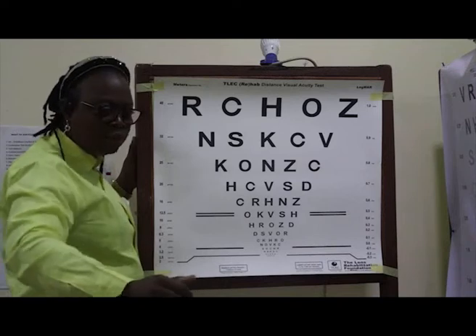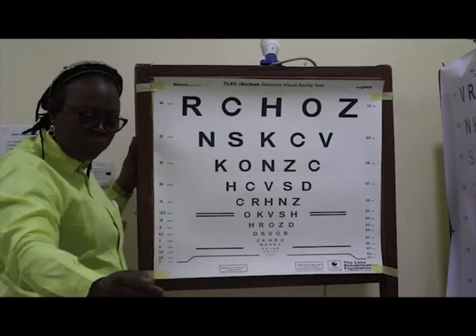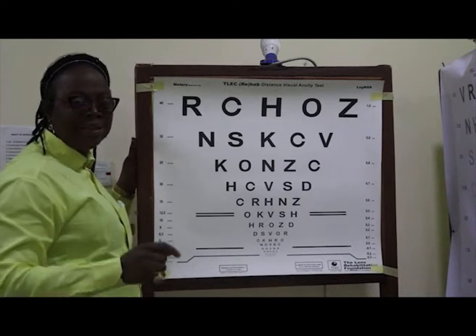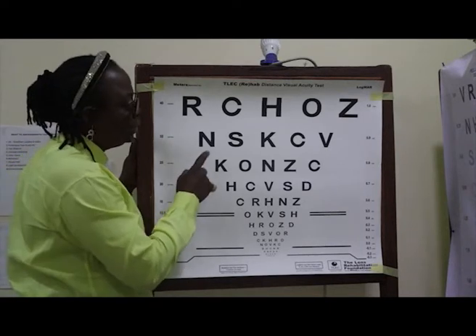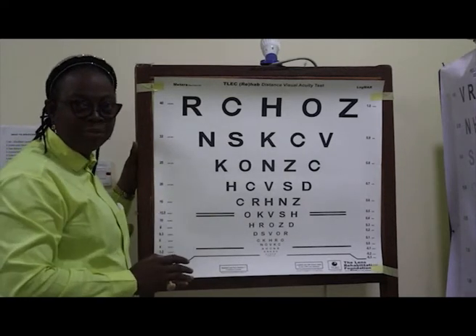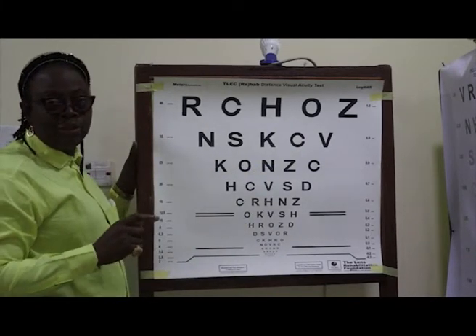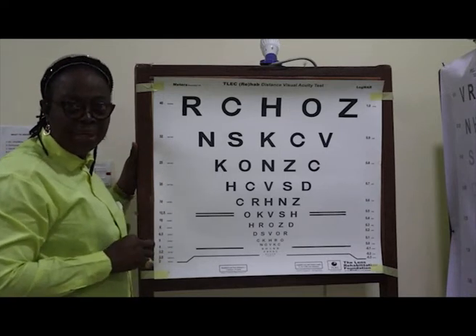Now, assuming the patient could not read even at 2 meters the biggest line here, then you move the patient again, halving the distance, to 1 meter, and then you add another 0.3, making 0.6. So the visual acuity is 1.6 LOGMAR. Then you halve the distance again to 0.5 meters, and if the patient could not read anything here, that will make the visual acuity 1.9 LOGMAR.